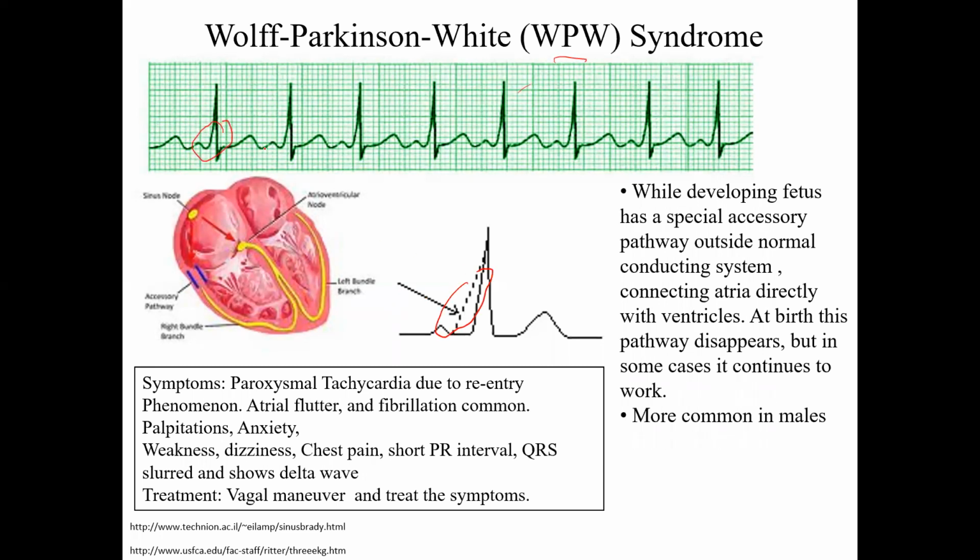To me, it looks like the sail of a sailboat, right on the mast, kind of coming out a little bit early. P wave is there. Other than the delta wave, it's a normal QRS. So this is really subtle. You have to look at that.